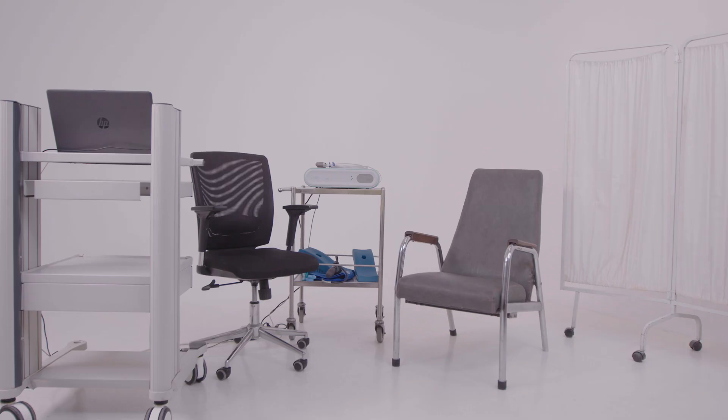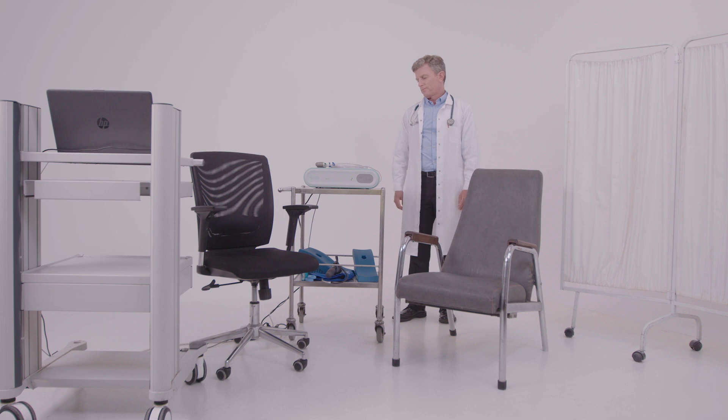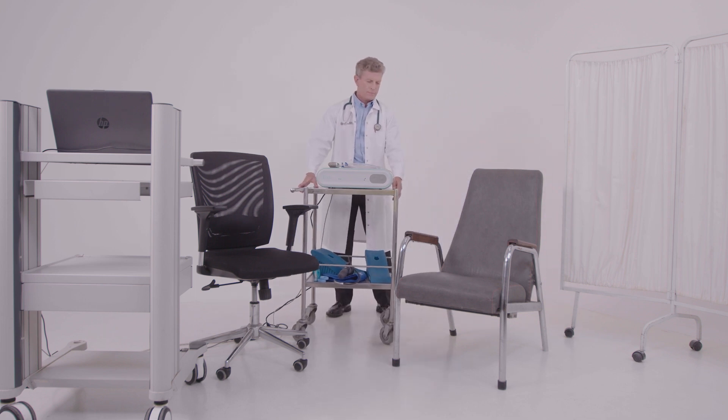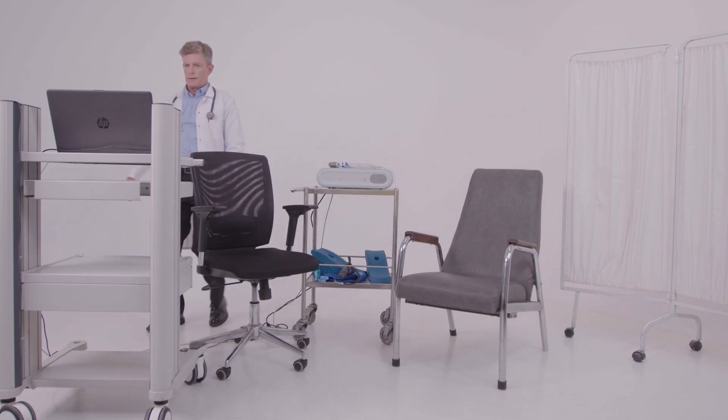This video will show you how to prepare a study with the EndoPAT X. First, turn on the system for at least 20 minutes before starting a study. Make sure the device is about 1 to 2 feet, or 33 to 66 centimeters, from the patient, and the laptop screen is positioned away from the patient.